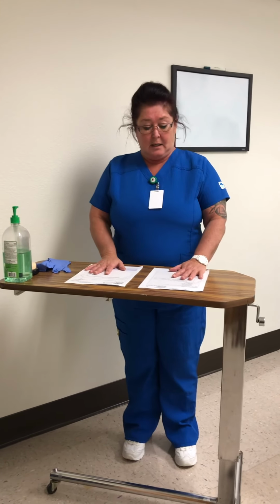My name is Tiffany, and I'm going to be demonstrating IM and ID injections. First, I have checked my lab values for the patient. I have obtained my doctor's orders as well as my MAR. So the first thing I need to do is compare the two for discrepancies.